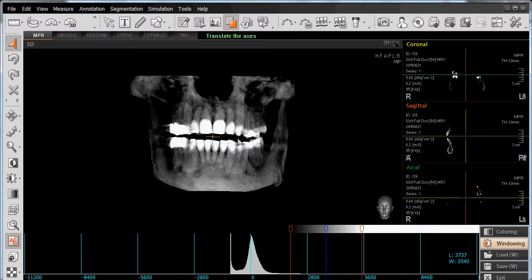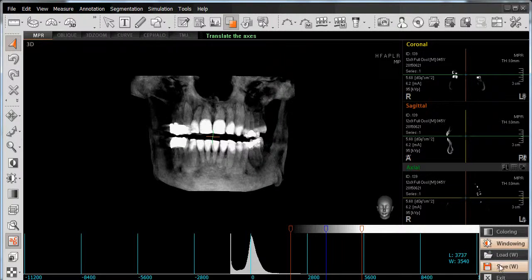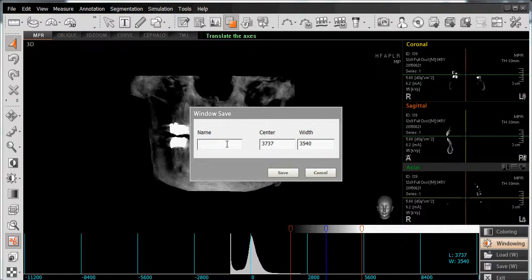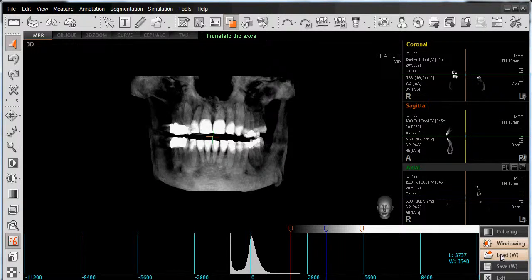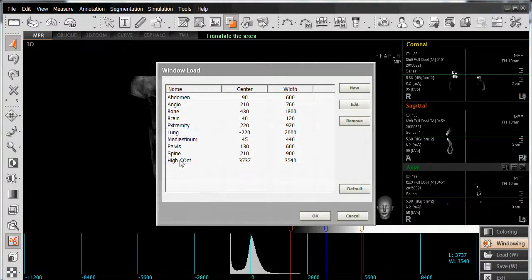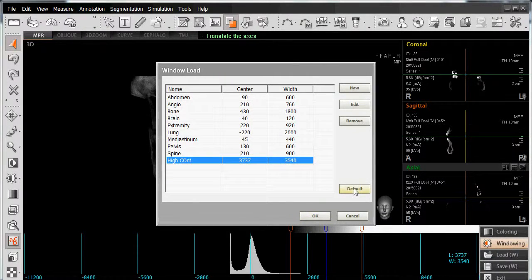Once I've created my desired effect, I can also save this in my opacity library. We'll go down to our menu again, left-click on Save, and specify our name, such as high contrast. Left-click on Save, and then to access it, left-click on Load, select it, and then apply it on a per-patient basis, or as a default for every scan you open on this computer.